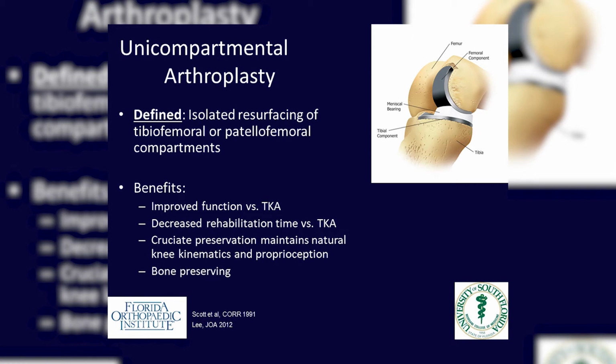It's really defined as the isolated medial or lateral tibiofemoral resurfacing, or also would be considered a patellofemoral resurfacing, but we're not going to discuss that today. Certain benefits are improved function over total knee arthroplasty, decreased rehab time and recovery time versus total knees. Cruciate preservation will maintain a more natural knee kinematic pattern and proprioception for the patient. And of course, this is a bone-preserving procedure relative to a total knee.